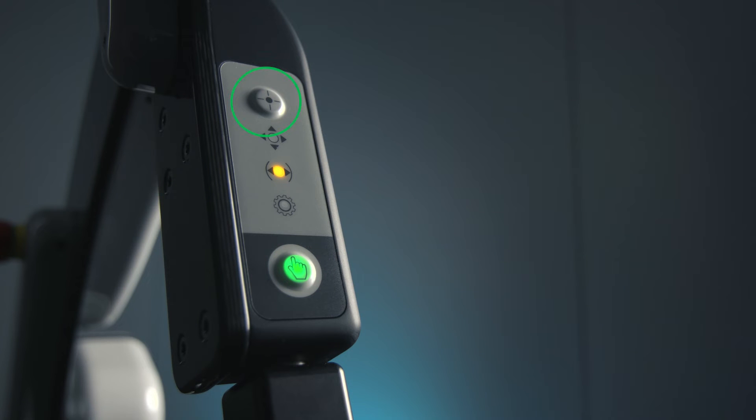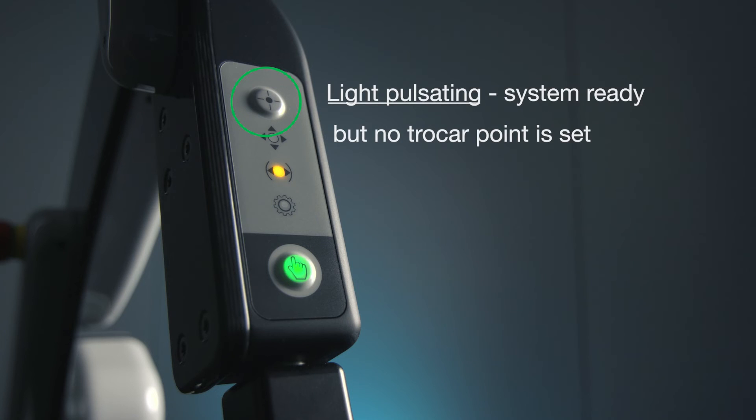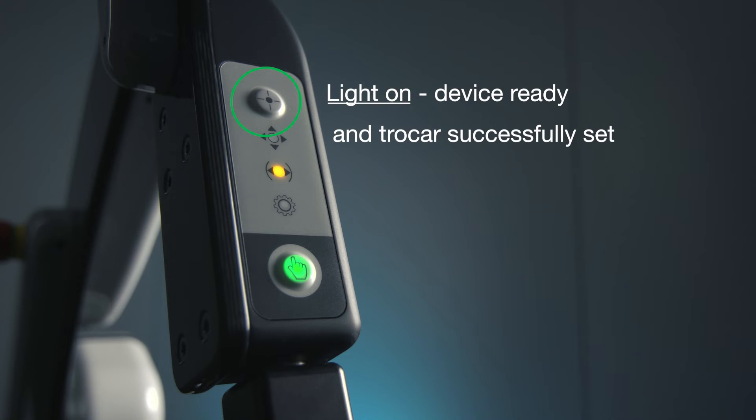The top button sets the trocar point. The light is off if no joystick is connected. When the light is pulsating, the system is ready. When the light is on, the device is ready and the trocar point has been successfully set.